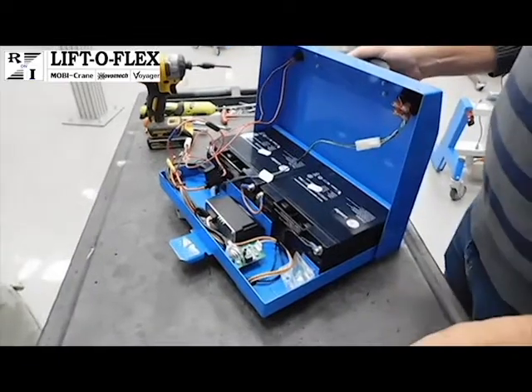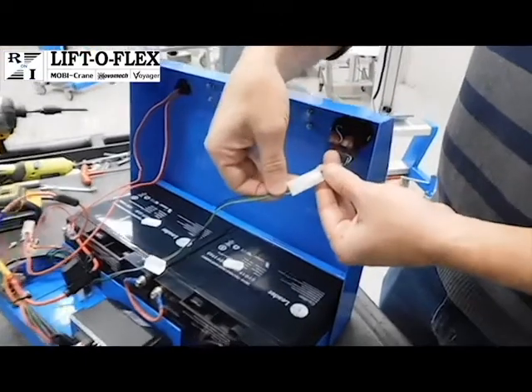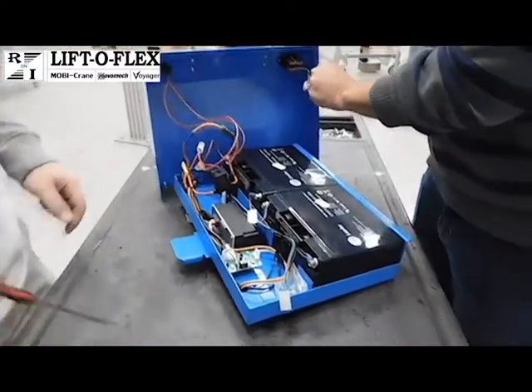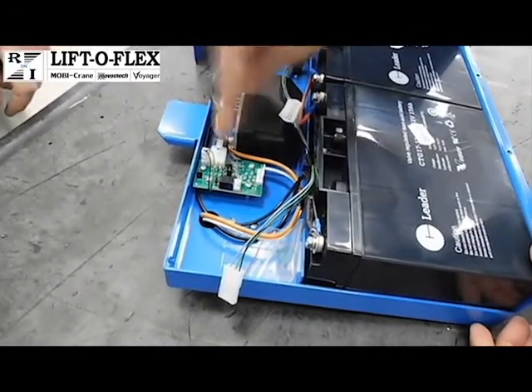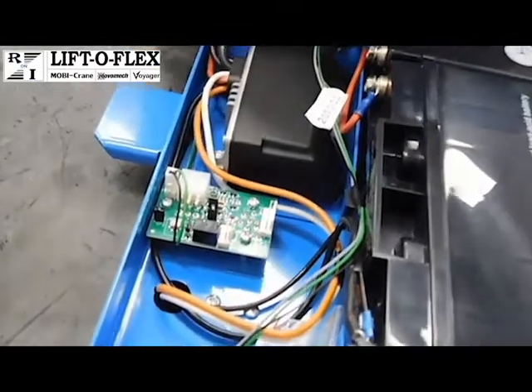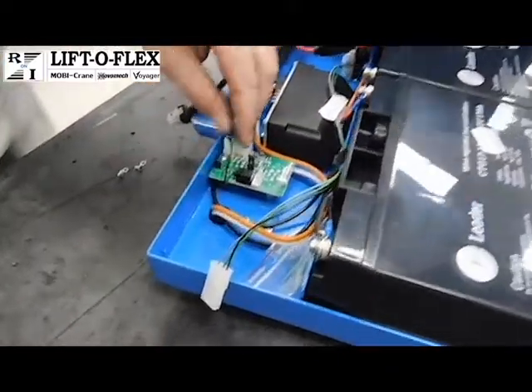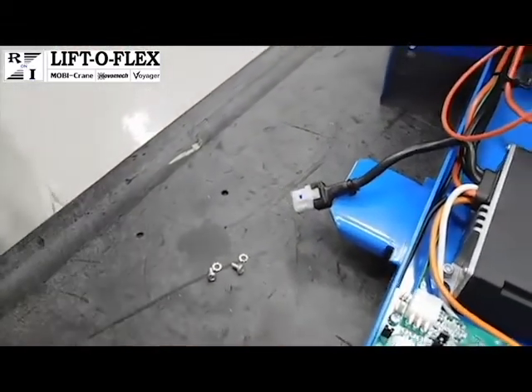The item we're going to replace is the interface card, but before doing that, if you disconnect the Molex connector that goes to the battery indicator, it'll allow you to move the battery cover off to the side, just giving you more access. All right, so the first item we're going to replace is the interface board. The first thing to do is to remove the Molex connector that connects it to the control card. There's a tab and it pulls out, and then there's 3 Phillips head screws that will need to be removed. And please note there's also serrated washers that go with those screws that need to be used when you reinstall.